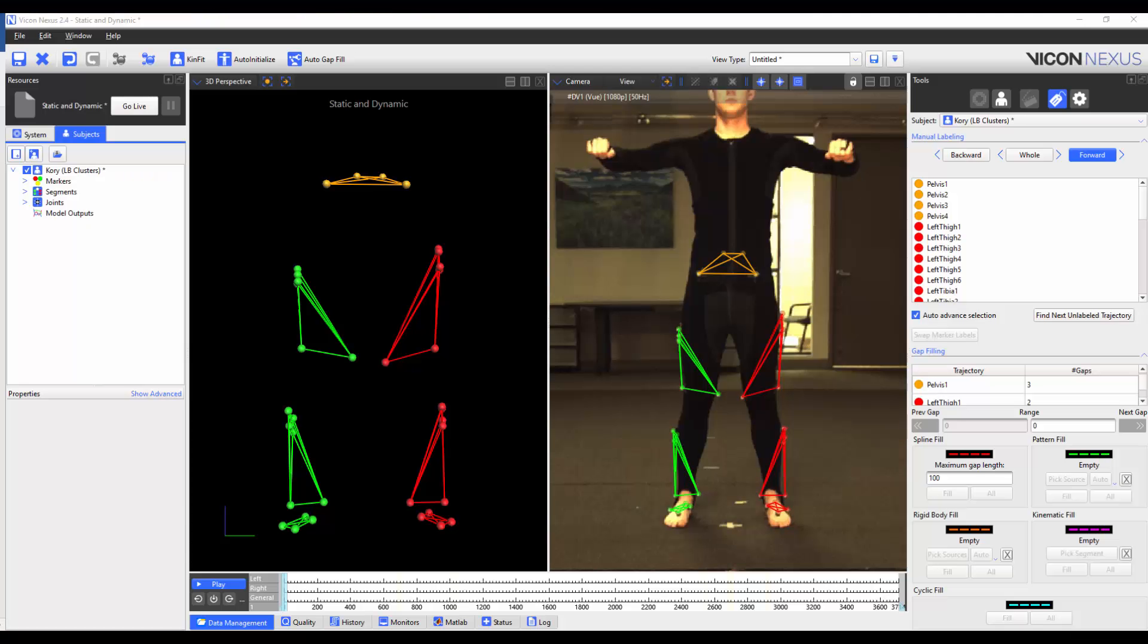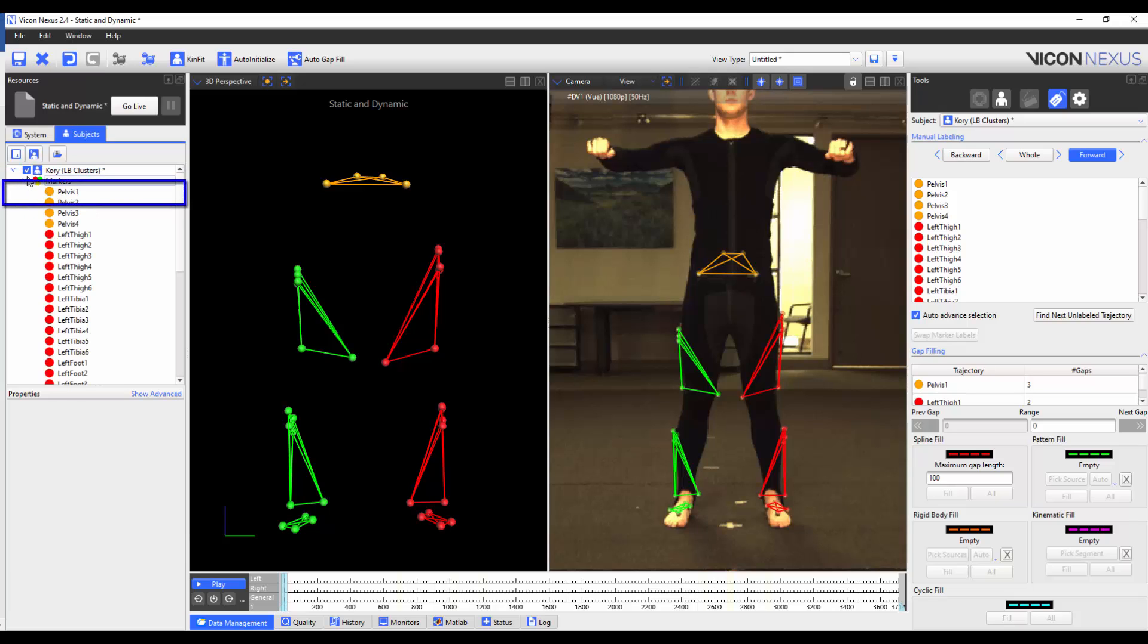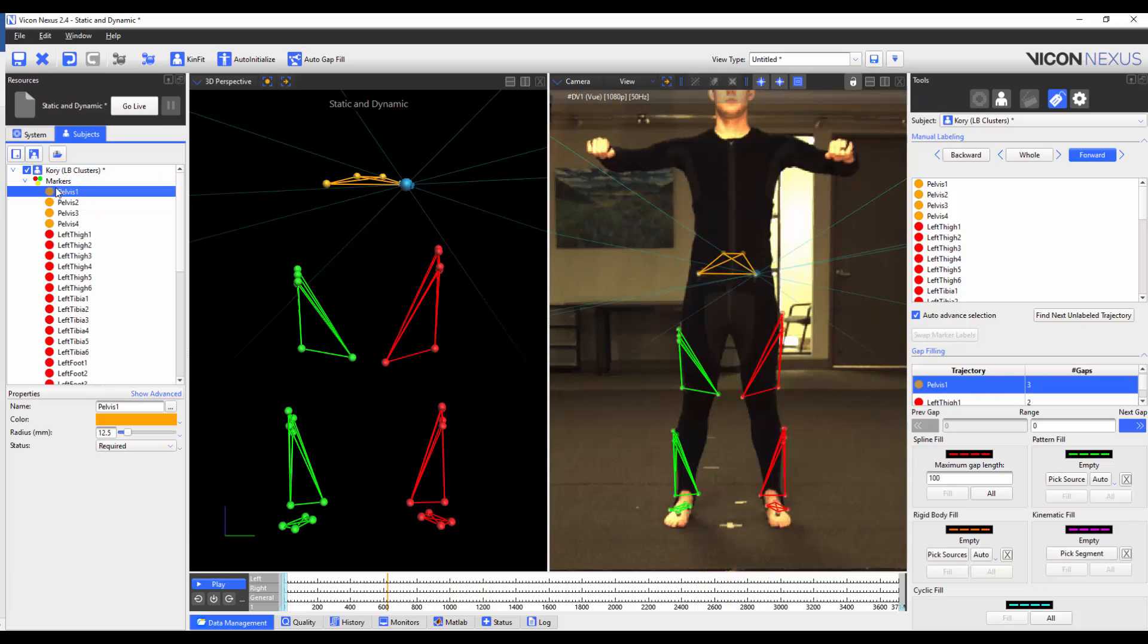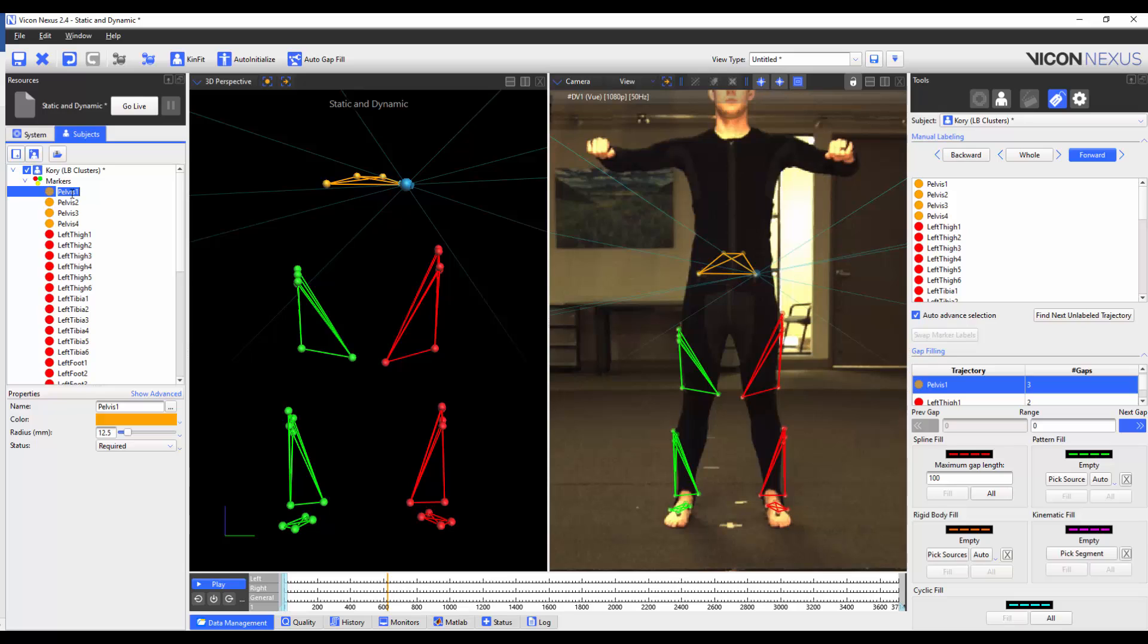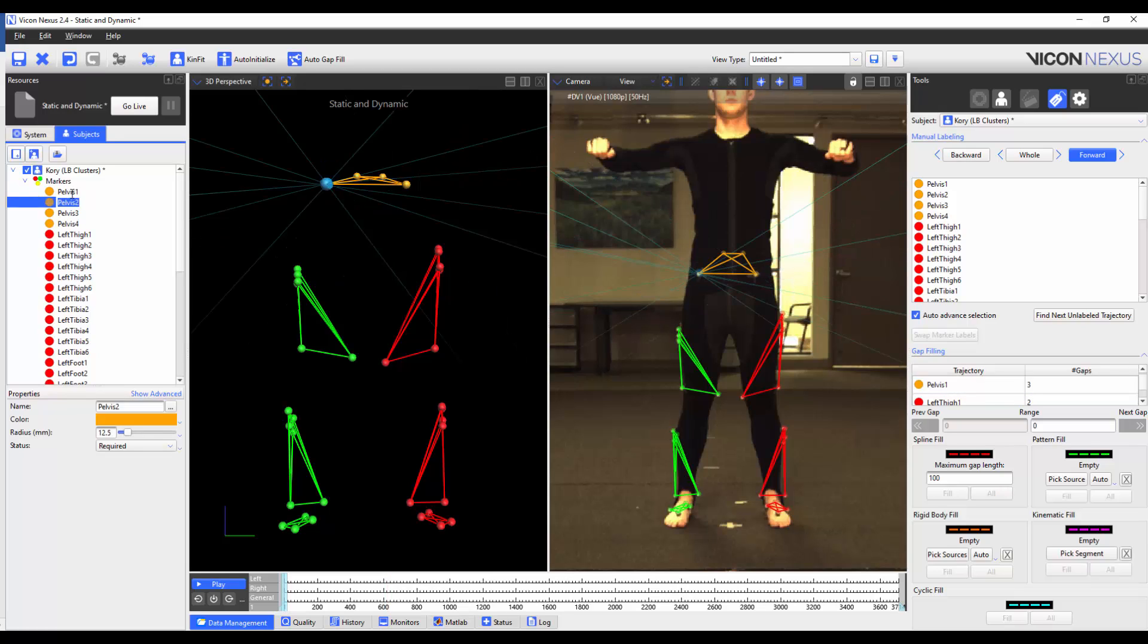We can also change the marker names. To do so, I'm going to expand the markers list and select the first marker. I can either change the marker name in the Properties, or I can double-click on the marker name and change the marker name appropriately. I can then press Tab to proceed to the next marker and change that name accordingly too. I'm going to repeat this process until all markers are named.